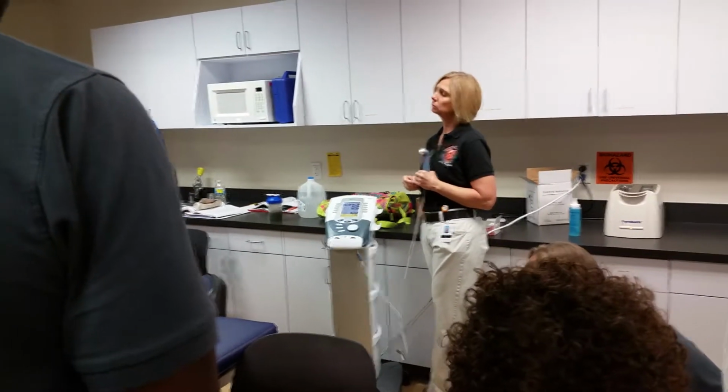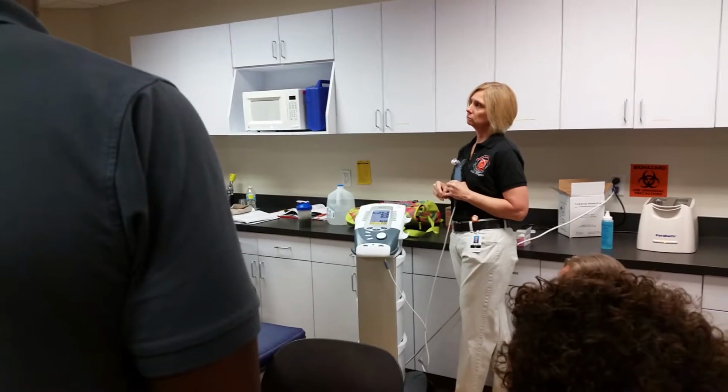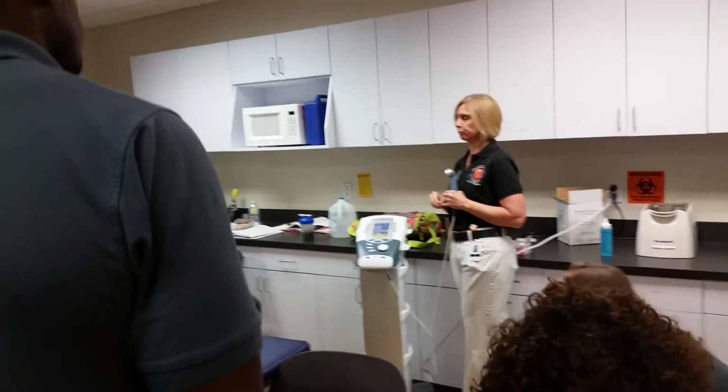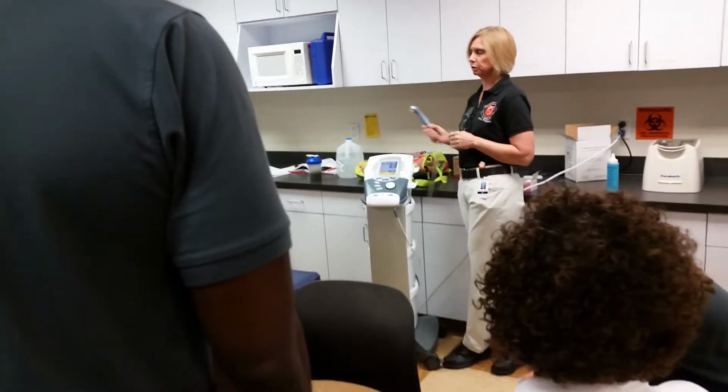Yes? If it only takes a minute, is that the same type of thing like ultrasound where you can only charge if it's 8 minutes or more? Well, that's just to get to the therapeutic level. You're not stopping the treatment. Oh, okay. You're going to continue doing the treatment for the full 8 minutes. You stop increasing the intensity, okay. You leave it there, and now you complete your treatment.